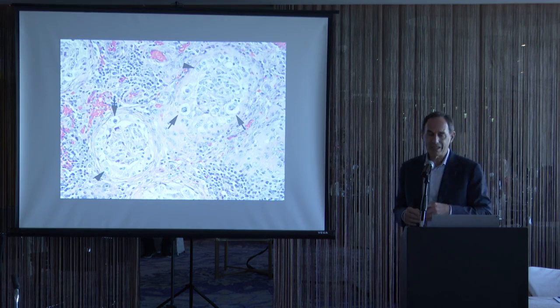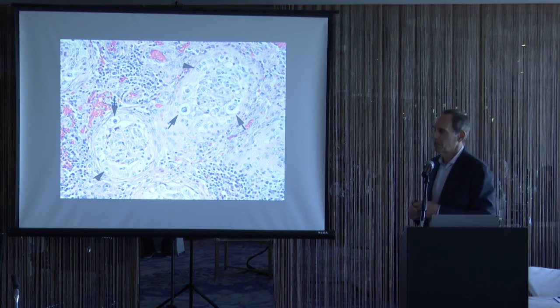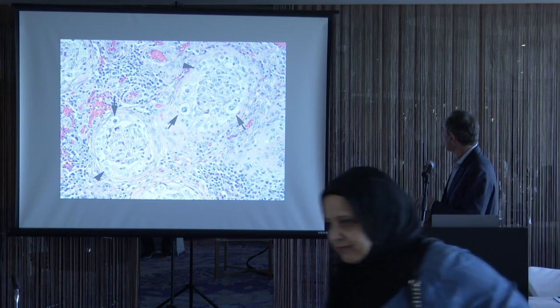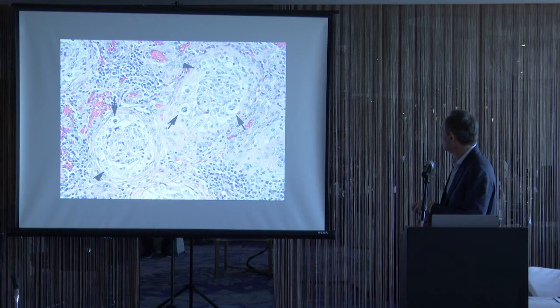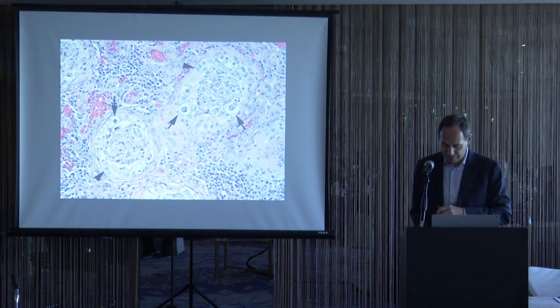Now, sometimes the intratubular germ cell neoplasia or intratubular seminoma can also develop a granulomatous reaction, which can mimic, or I should say mask, the germ cell neoplasia component. So here we see this granulomatous inflammation within tubules. They're within the seminiferous tubules, and they're reacting to the germ cell neoplasia in situ, just like one sees granulomatous reaction reacting to the invasive component.